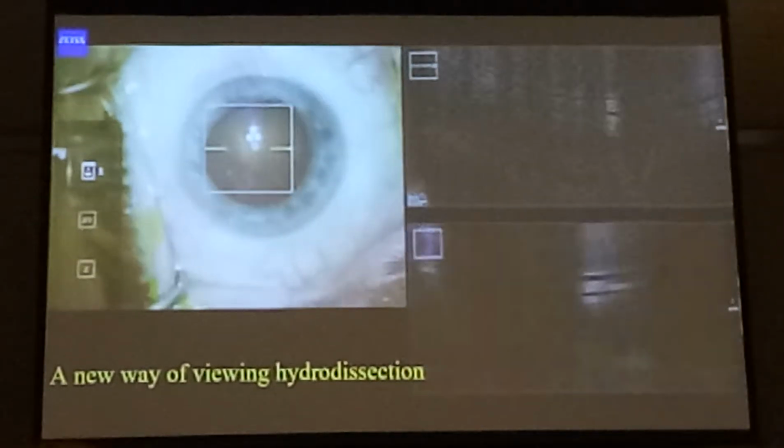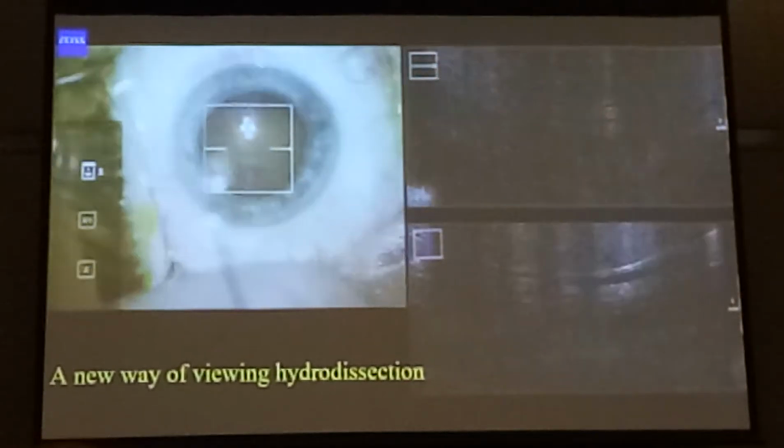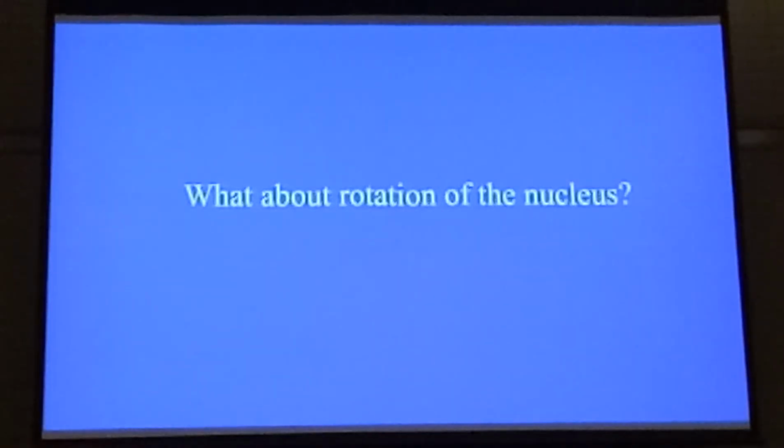So this live OCT view is something that's available on the latest generation Zeiss Rescan microscope, which I've been really using a lot for cataract surgery. It's very expensive. It doesn't really help you do cataract surgery, but as a teaching guide and as a research tool, I think it's very, very important. Because you can see from here now how much fluid goes in, and I can judge the quality of my hydrodissection from doing that.